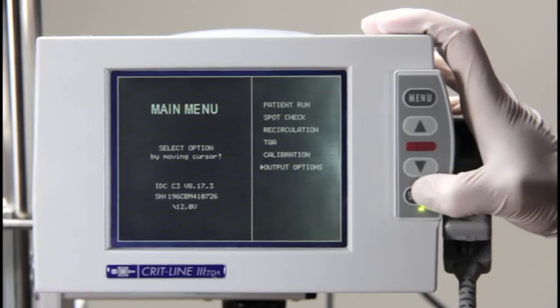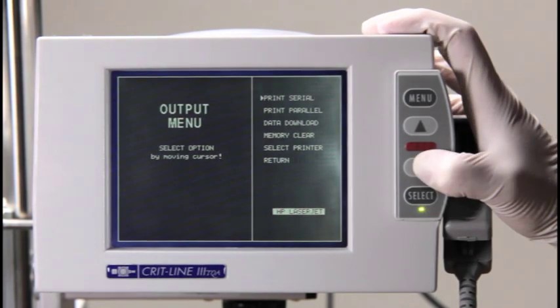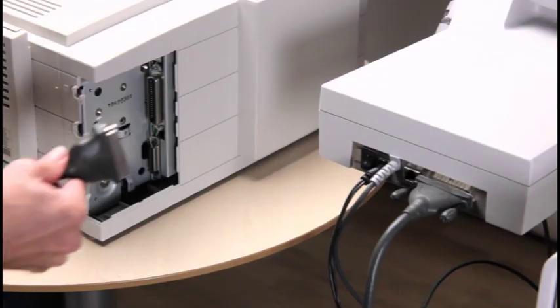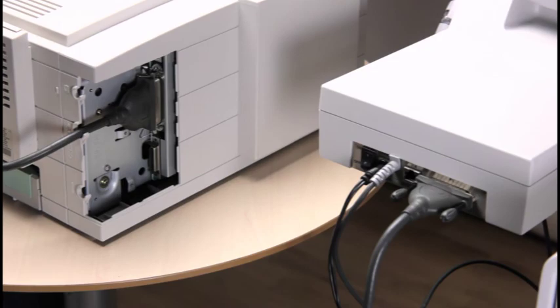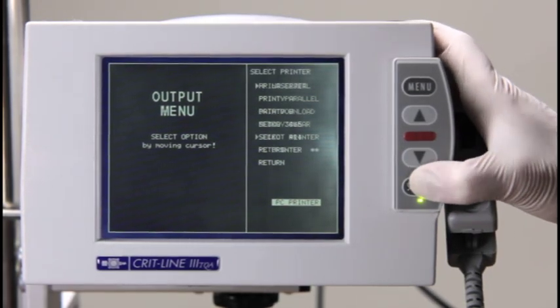From the output menu, you can select how you want to print the treatment profile as well as choose your printer. To choose a printer, move the cursor to select printer and press the select button. There are three ways to get printouts or data of the treatment profiles: direct connection to a printer, wireless connection to a printer, and via the Reporter Software. To make a direct connection between the printer and the CRITLINE monitor, you will require a printer with a parallel port and a standard 25-pin Centronics cable. Once the printing cable is connected to both the CRITLINE monitor and the printer, select Print Parallel and a treatment profile will print. Regardless of the printer manufacturer utilized, please select HP LaserJet as the default printer.